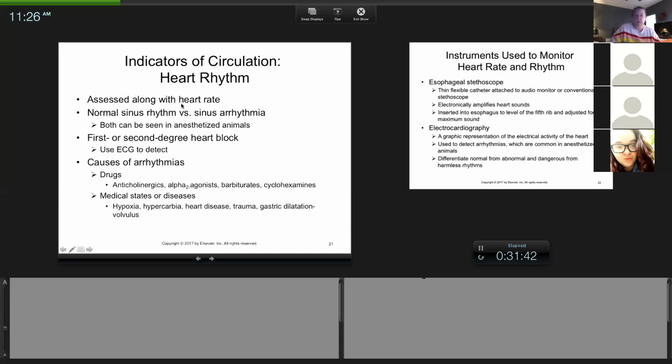You look at this with the heart rate. Obviously, if it's a pattern, it should be like a good song, and you hit this pattern in your head. Now, sinus rhythm is extremely normal. Sinus arrhythmia speeds up with inhalation and slows down with exhalation, and both of those are very common during anesthesia. It can happen, and again, it's a normal EKG tracing.